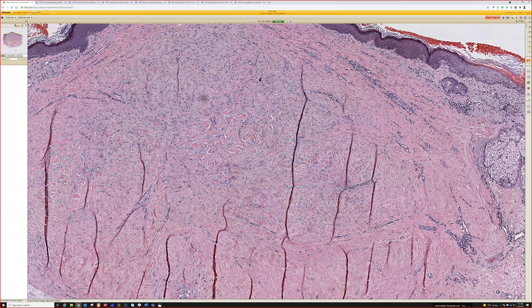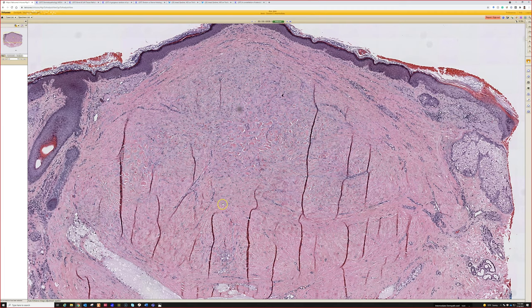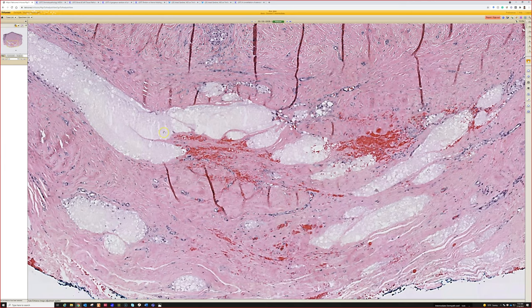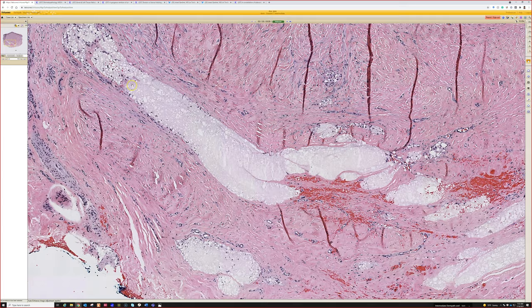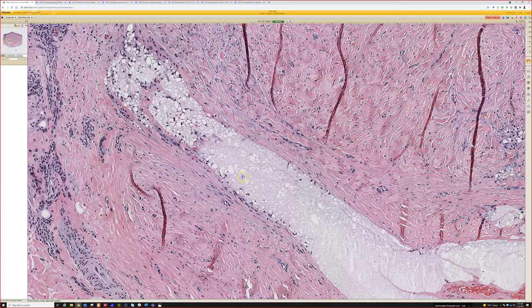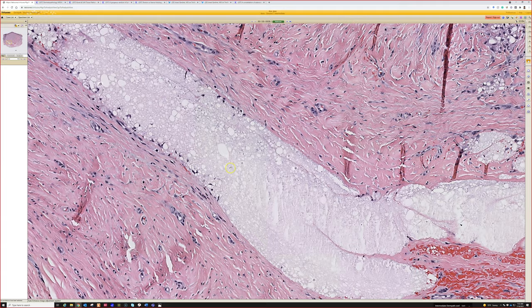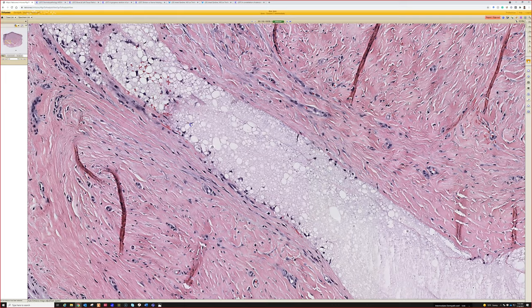Always remember, don't stop with just one thing. There are a couple of other bonus things here. This stuff — that's injected steroid. It's these little pools of bubbly, frothy, whitish material, and that's because steroids are lipid-based. So you get this frothy bubbly appearance because of the little droplets of lipid that wash out in the processing.